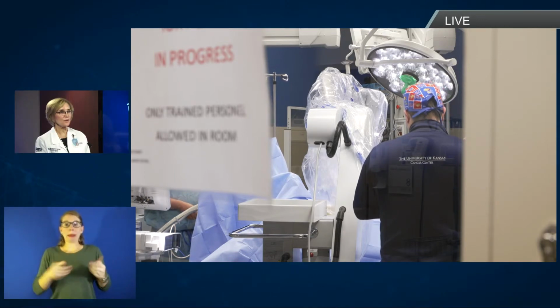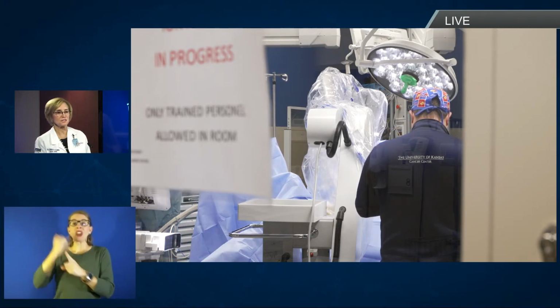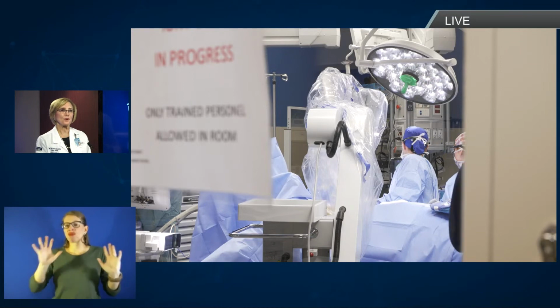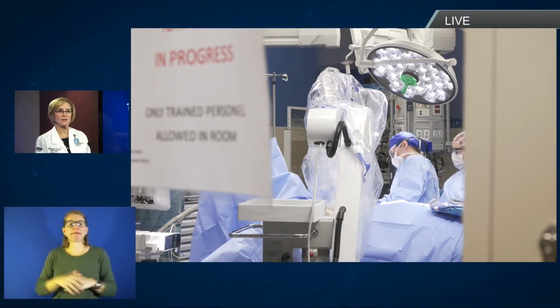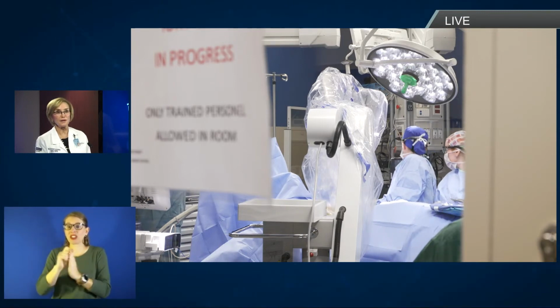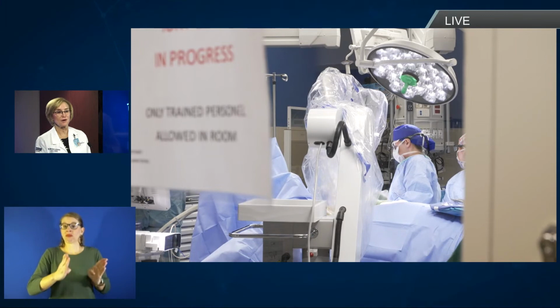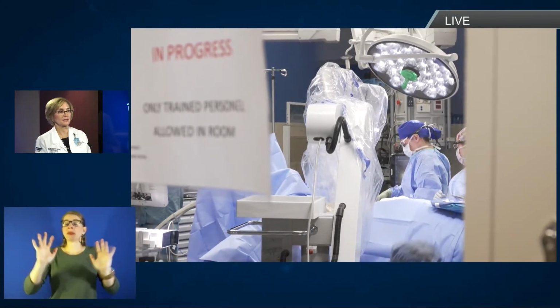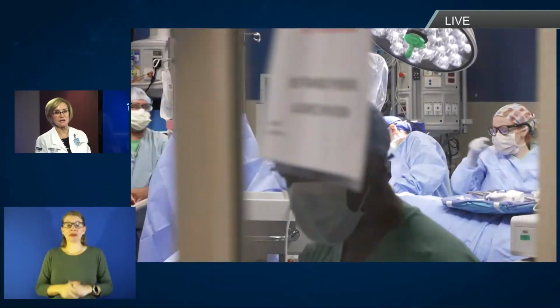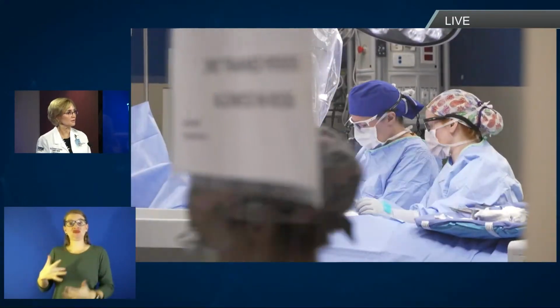Right. Well, I would kind of start with, historically, if you're a candidate for breast conservation, which is a lumpectomy, taking out the cancerous lump, you would be signing on for about 4 weeks of radiation in order to reduce your risk of recurrence as low as that of a mastectomy patient. But because we have this technology here, we can offer shorter treatment courses, even as short as 1 treatment with radiation during your operation. And so women are thrilled with that option. They're extremely excited. And some have sought us out as second opinions specifically for IORT, but most we present it during our clinic, and they're just thrilled that this could be an option for them.